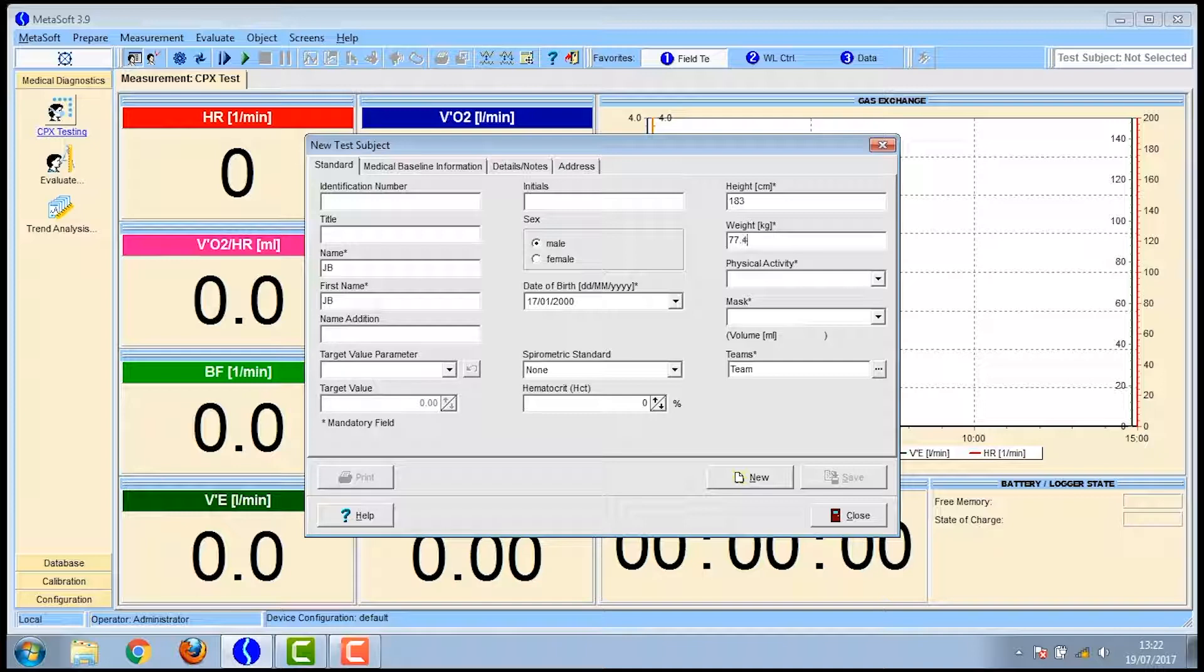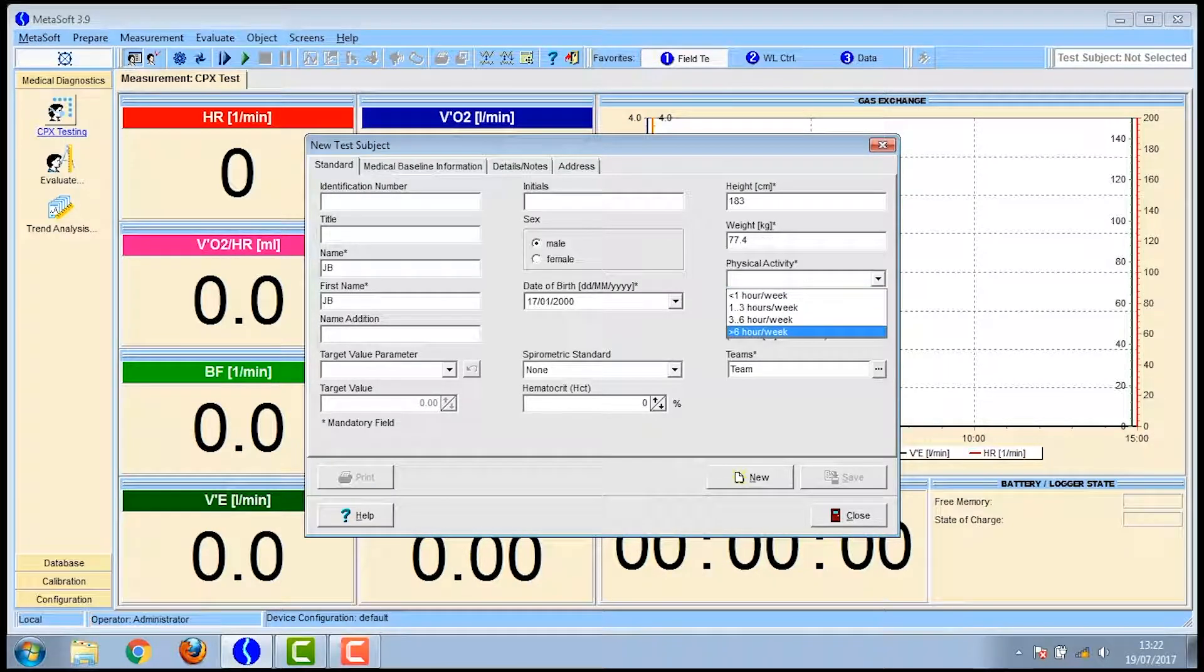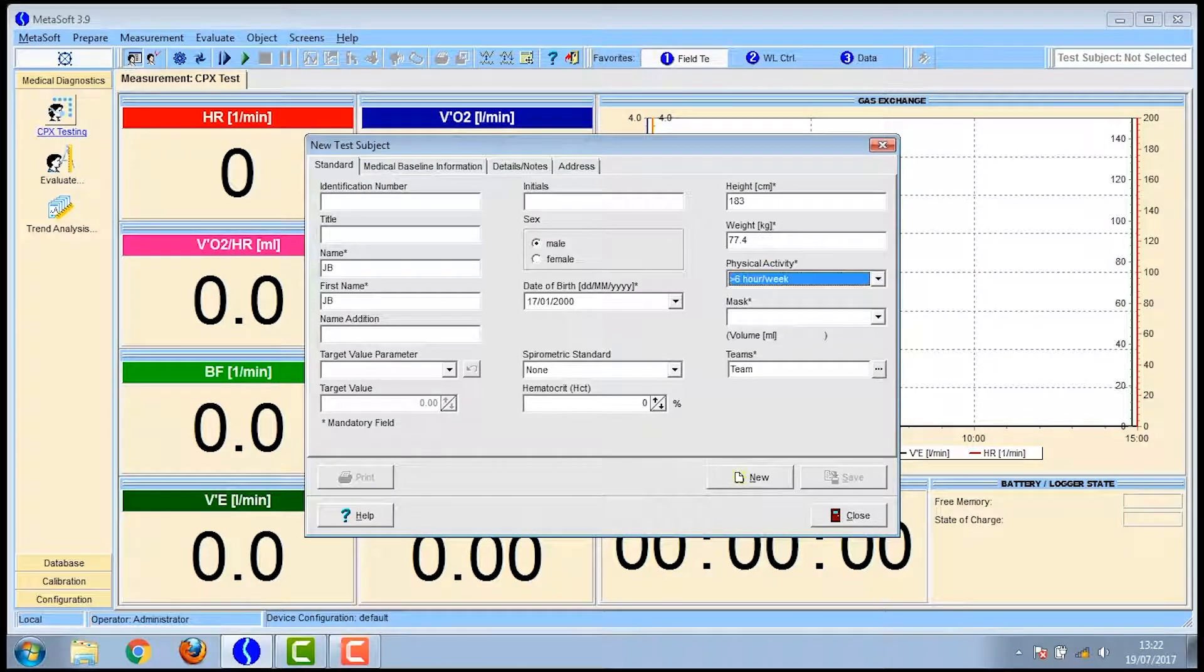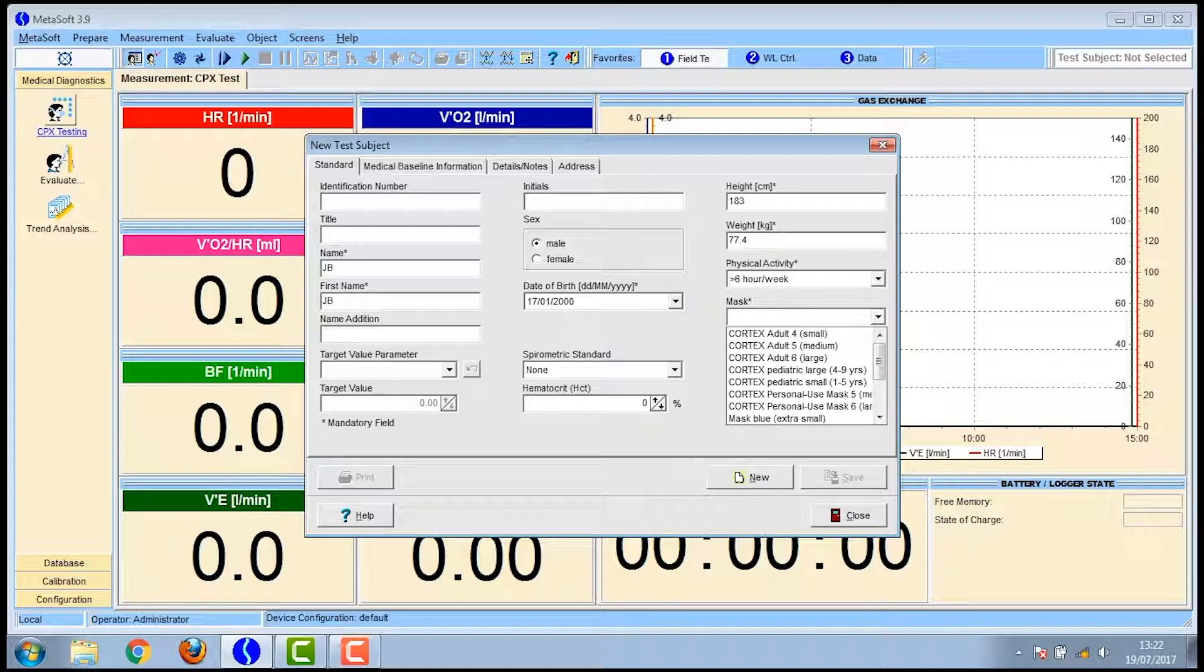You'll also need to choose a physical activity level as well as a mask size. You can find the size of the mask at the bottom on the front of the mask itself. Once this is completed click close and you are ready to go.